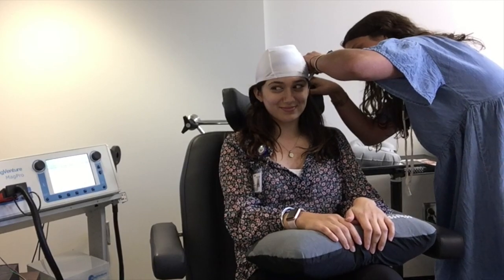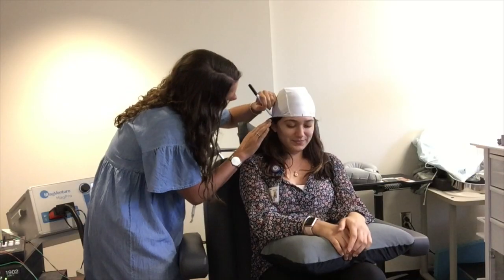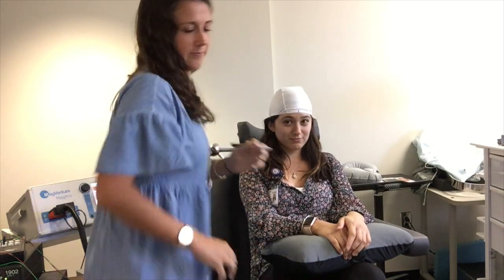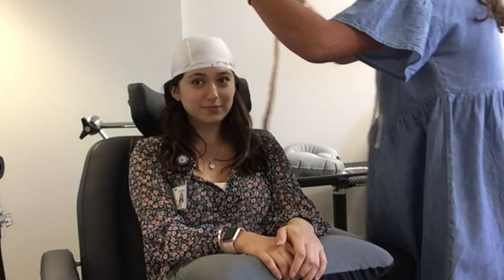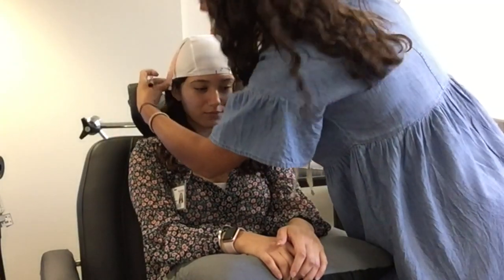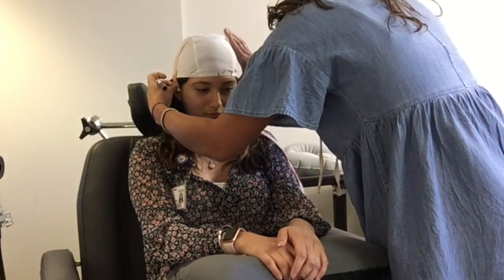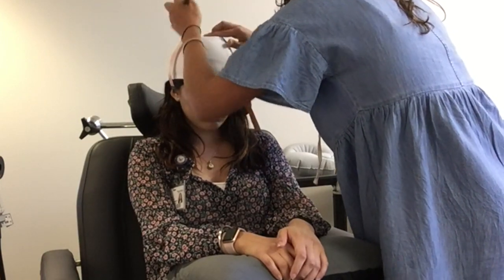You'll begin by marking on each side of the ear, down the center of the forehead, and on each side of the opposite ear. From there, you'll measure from the nasion to the inion and mark on each side of the ruler. Then by measuring from the right tragus to the left tragus and marking on each side of the ruler. This allows you to find the apex of the head.